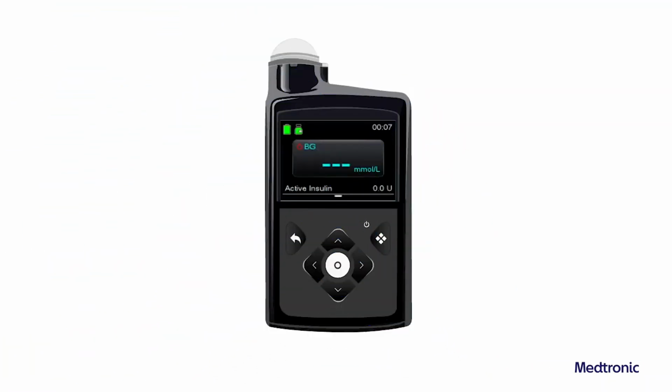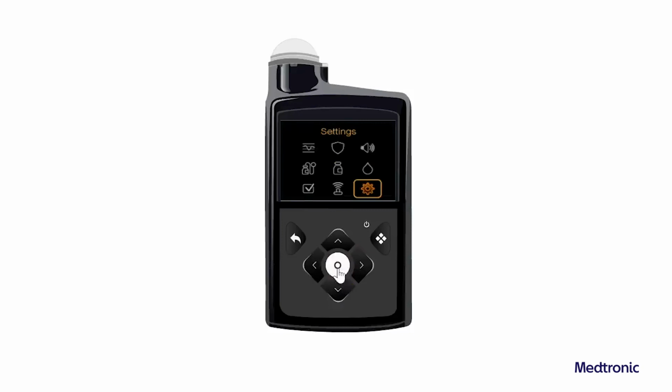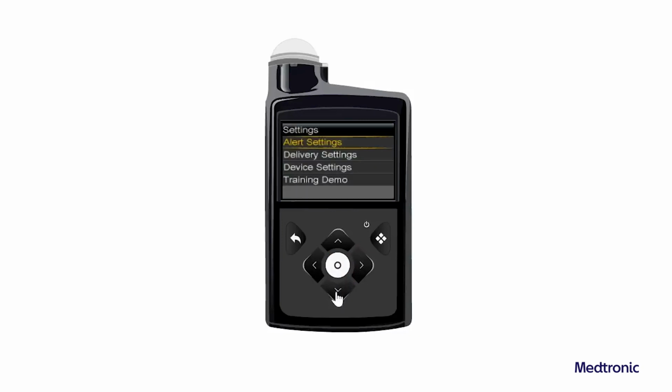To add an additional basal pattern, from the home screen, press Select and then select Settings. Select Delivery Settings and then select Basal Pattern Setup. The Basal Pattern Setup screen appears. To add a new basal pattern, select Add New.